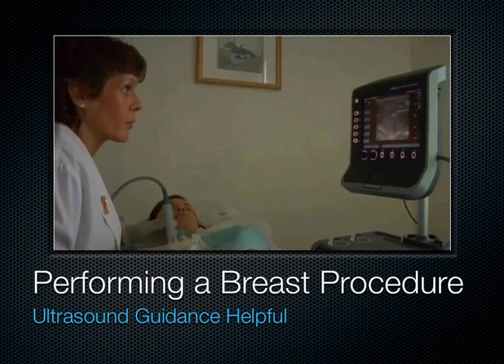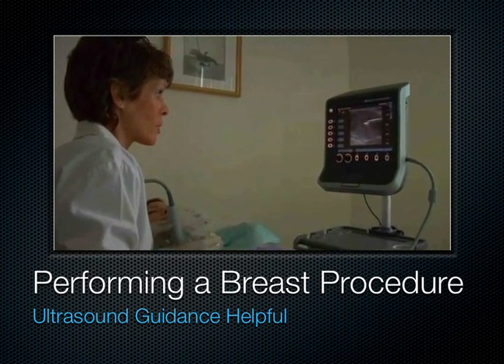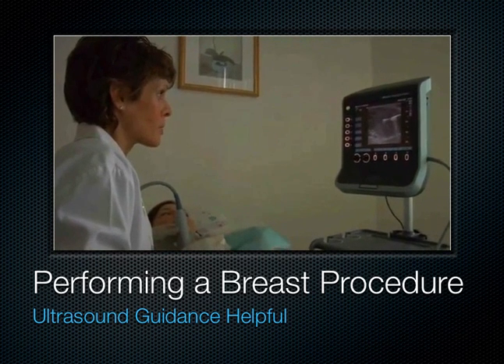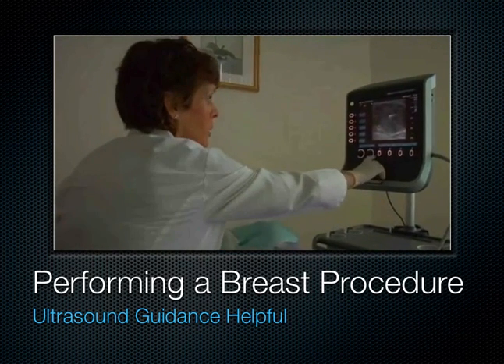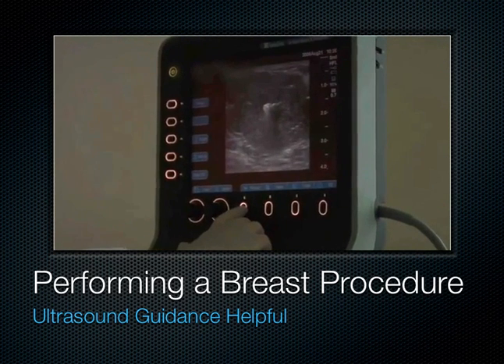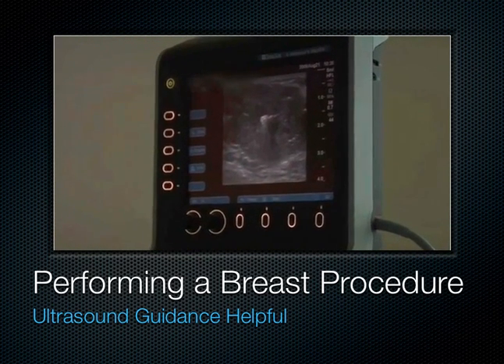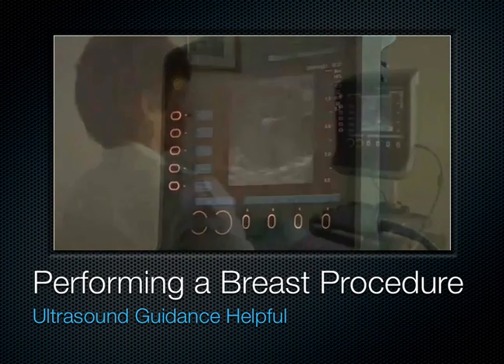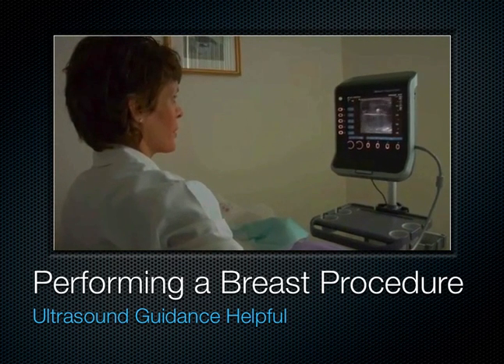This is actually a step we don't always do. In fact, if I've done the core biopsy, this is already done. It's pretty standard when you do biopsies to leave a marker in place, and especially with this procedure, because eventually the goal is that the fibroadenoma goes away. We want a record on our subsequent mammograms and images of where it was. Okay, go ahead and get started.